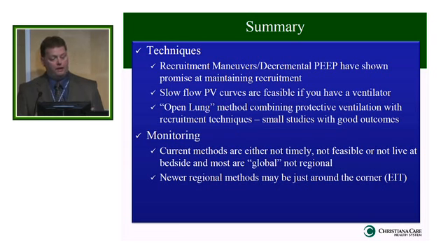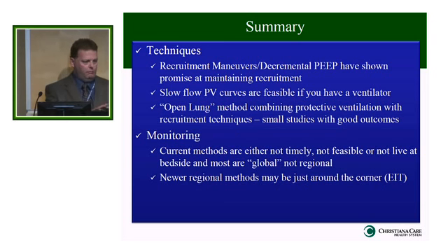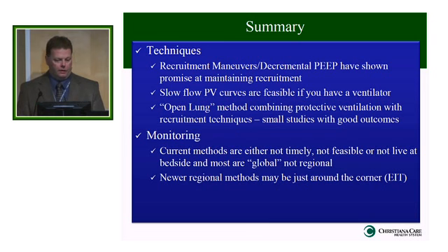Open lung method, I would keep it in your mind. Open lung method is a really nice method where you're using multiple of these things to get the lung open and then gently ventilating the lung once it's open. And small studies have shown very good outcomes with that.